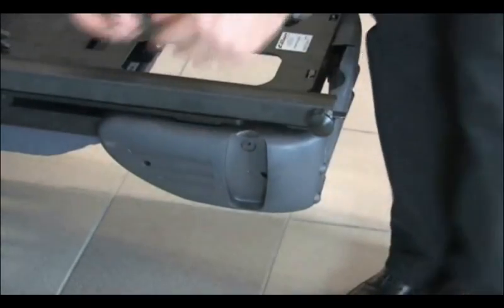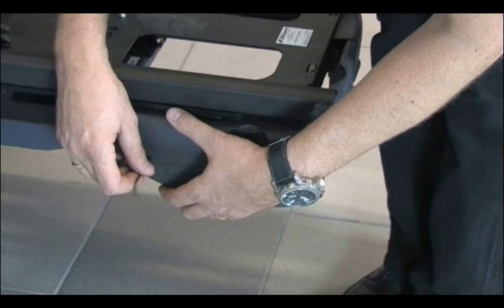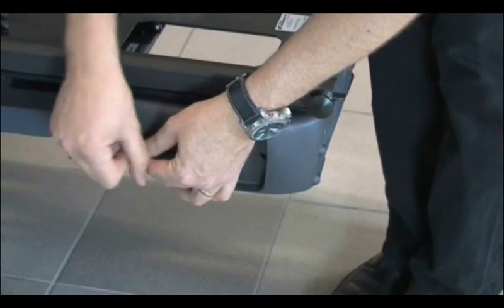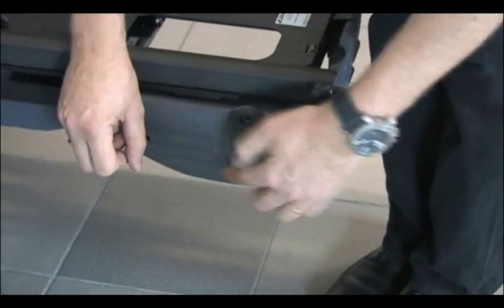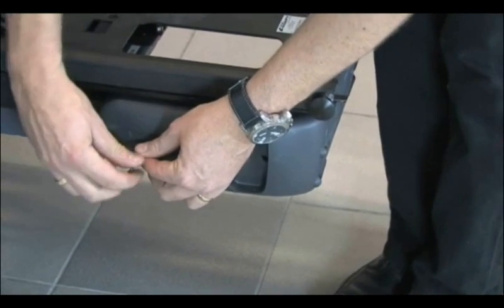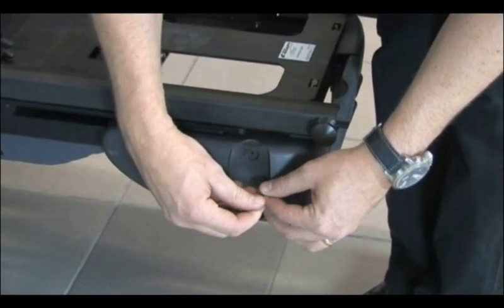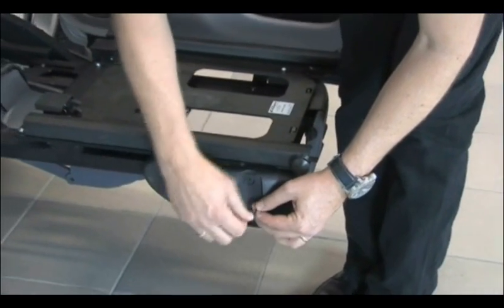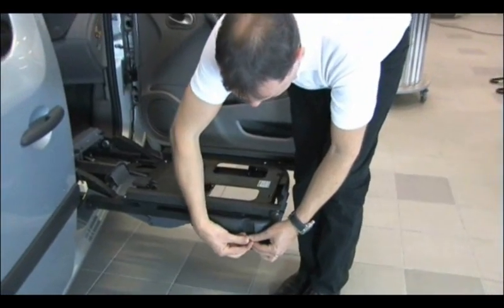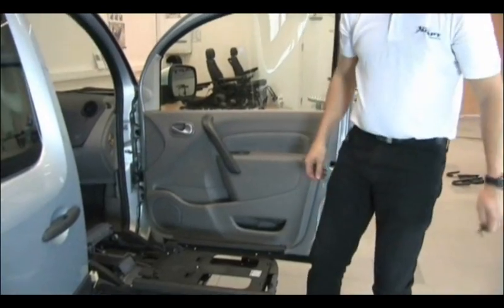Before you tighten it, you locate the other one. See if you can find the thread with this one as well. And it shouldn't be a problem, because if this one is lined up, it's normally not a problem. This one you can tighten immediately. And then tighten the front one. There you go, ready to use.